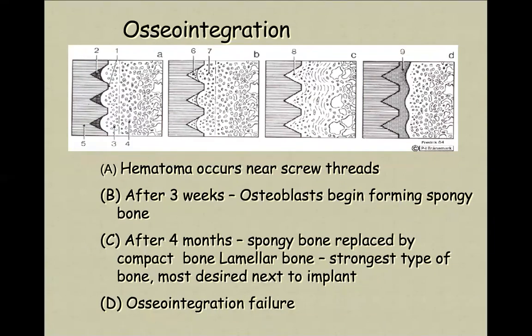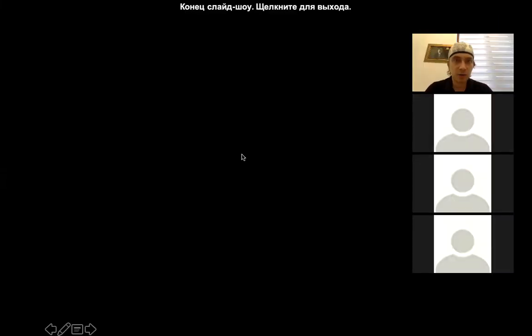And when I did this implant removal, what I found was the implant just surrounded by fibrous tissue that was very painful. We extracted the implant and the soft tissue as well, and she's happy at the moment. So that's it. Thank you very much for your attention. Do you have any questions?